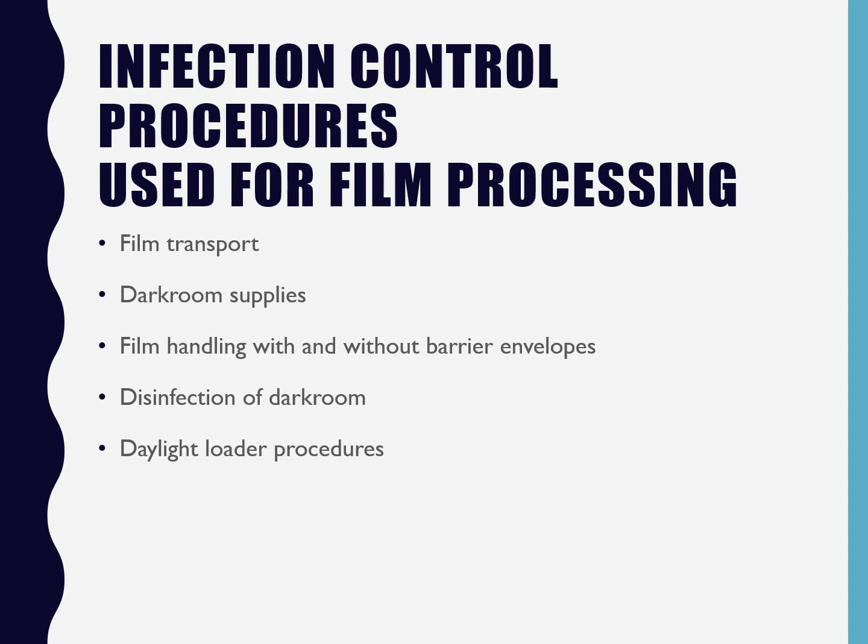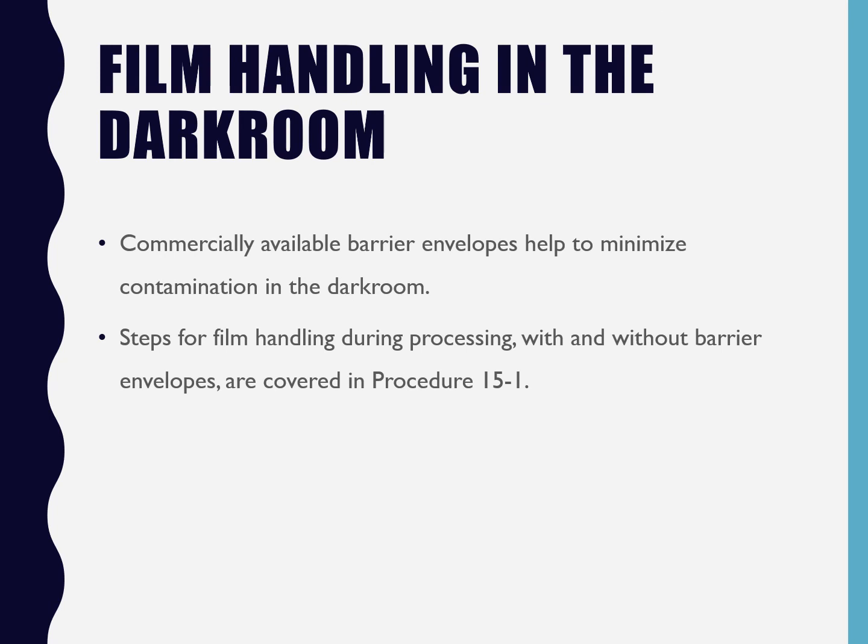And then the daylight loader procedures, I want you to keep in mind that this might be a little bit different. The book will describe it a different way than the way that we do it in clinic, because we are an educational institution and the book is telling you how to do it in private practice. Okay, so they have commercially available barrier envelopes that are used to minimize the contamination of the dark room.